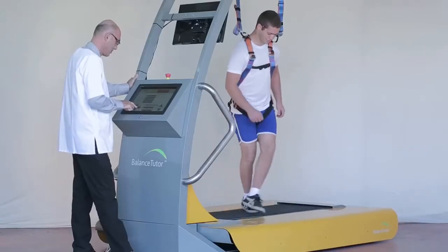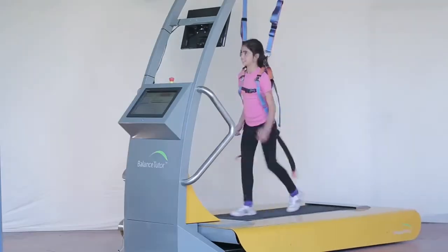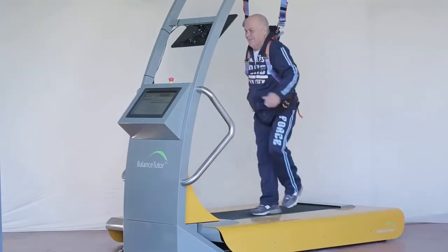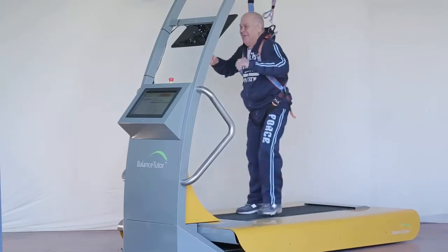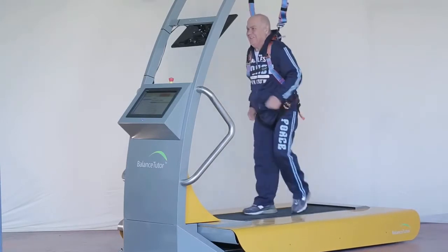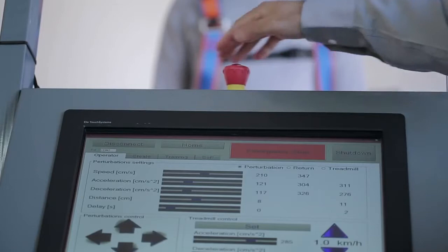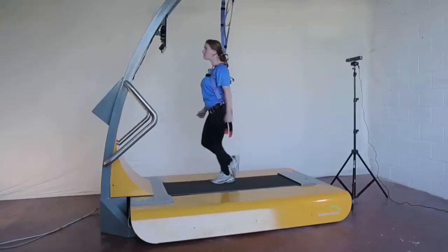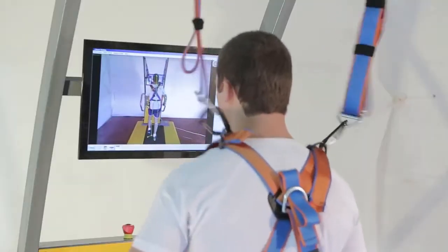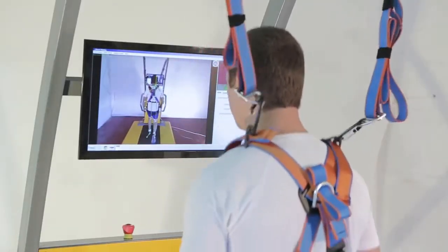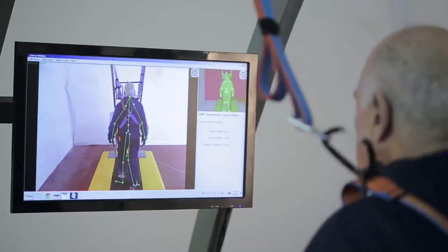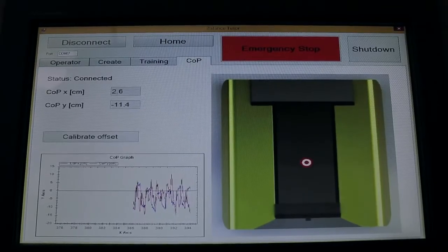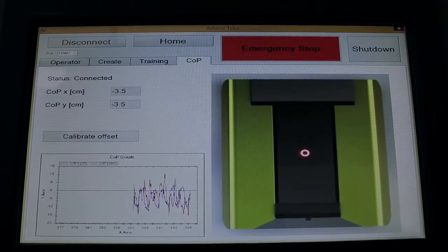The therapist customizes the training program and performs evaluations through integrated user-friendly software. The system is safe, as a safety harness and an emergency stop button are included in the Balance Tutor. The Balance Tutor allows the therapist to objectively and quantitatively evaluate compensatory step initiation time and performance, as well as gait. This is achieved by combining image processing and center of pressure measurements.